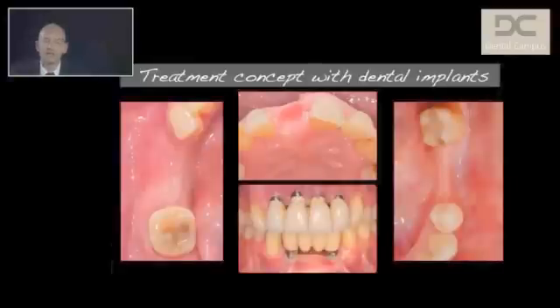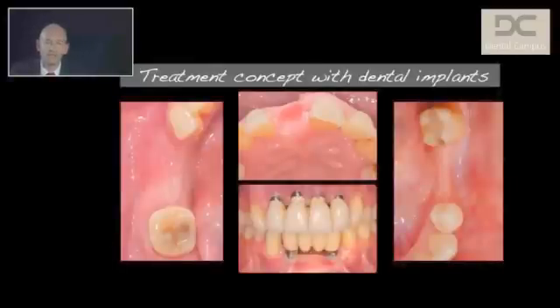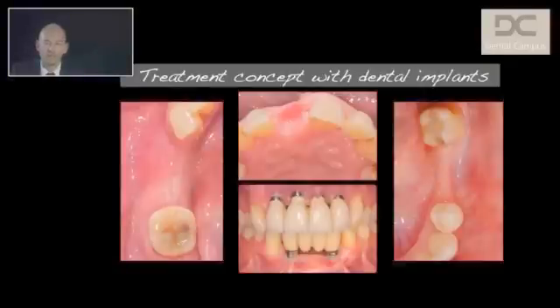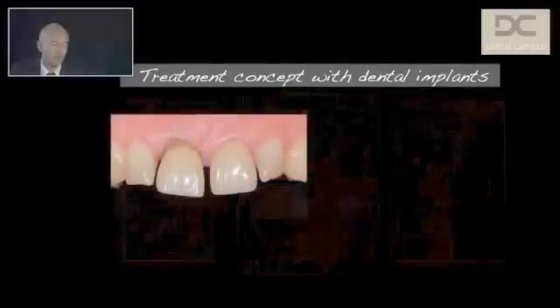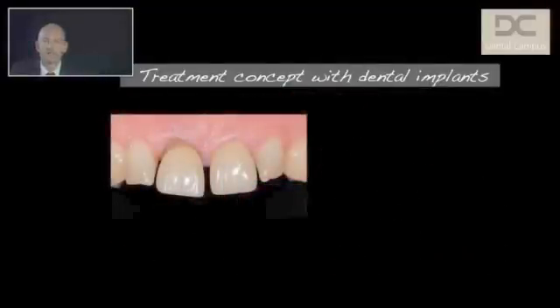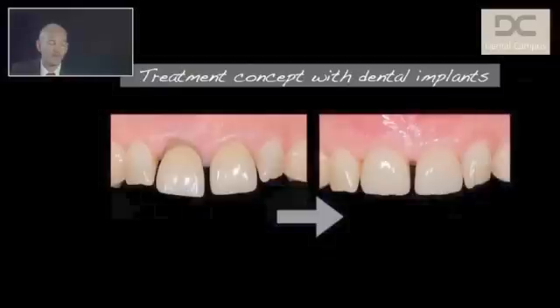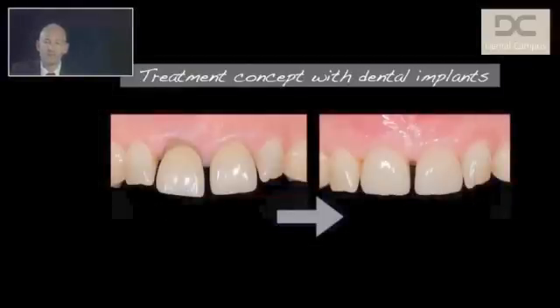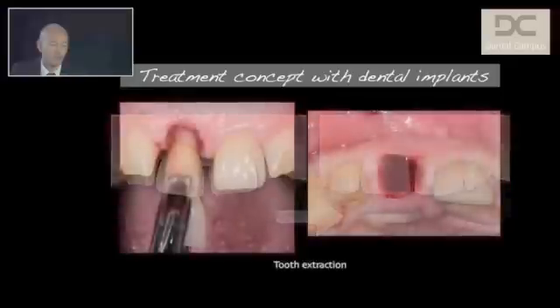As you can see here in the clinical pictures, all these cases need to be treated by dental implants, and in most of these cases you can see a deficit on soft tissues. I'd like to show you a clinical case. Here is the current treatment concept — the central incisor needs to be extracted, and following a long treatment period the case has been treated with a dental implant and an all-ceramic reconstruction.